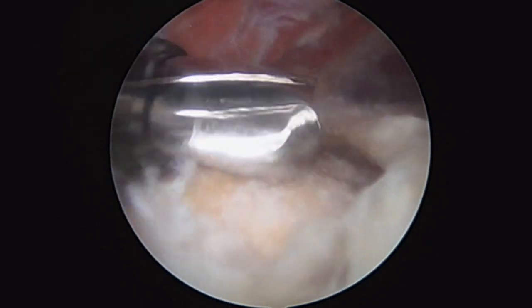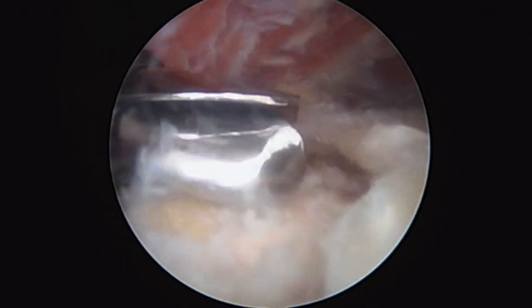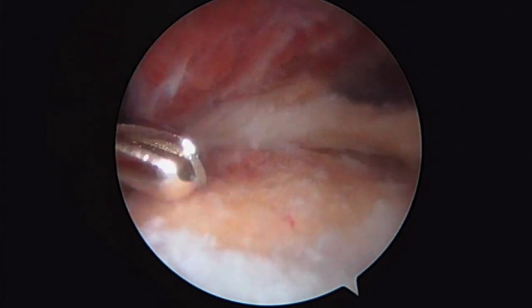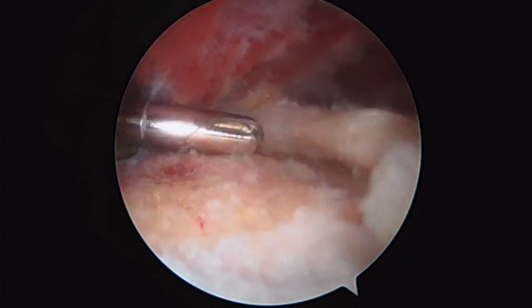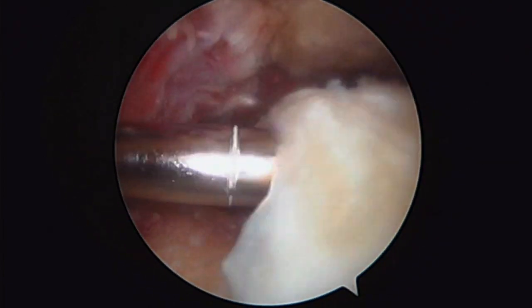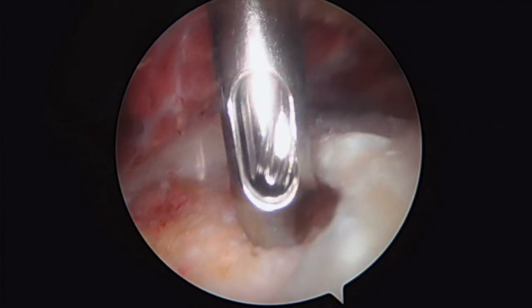That's step number one — preparing for our rotator cuff repair in order to improve our chances of success. A final look at our prepared bed of bone on the greater tuberosity of the shoulder. And now we're going to fix this rotator cuff tear right here. Here's our medial row anchor, and here's our drill.